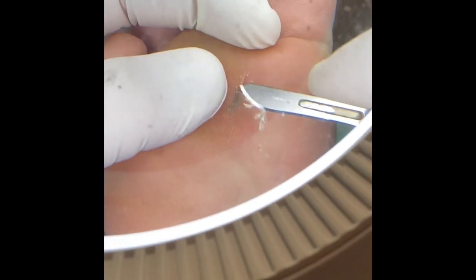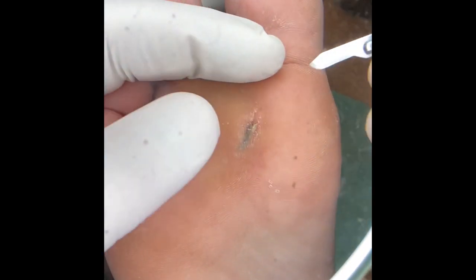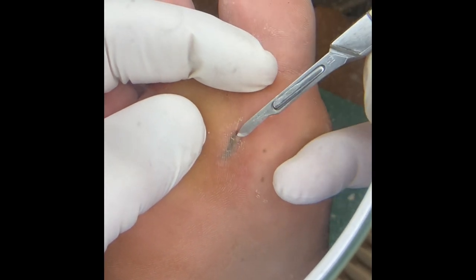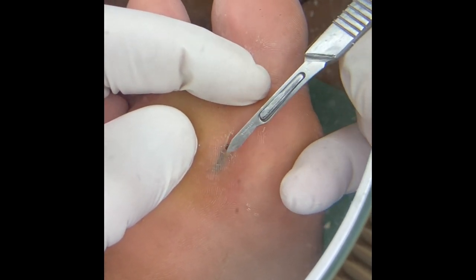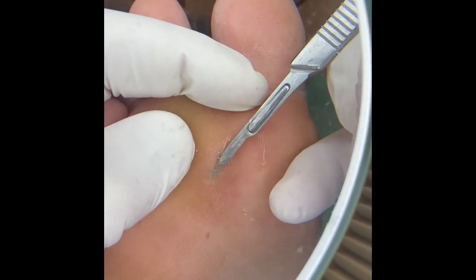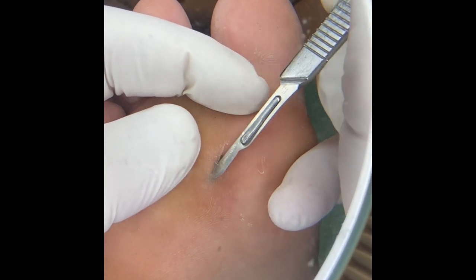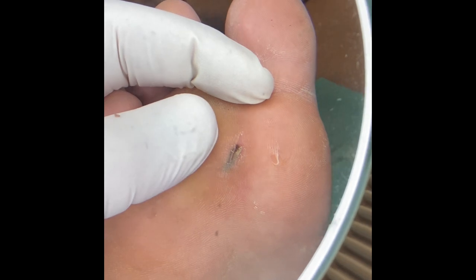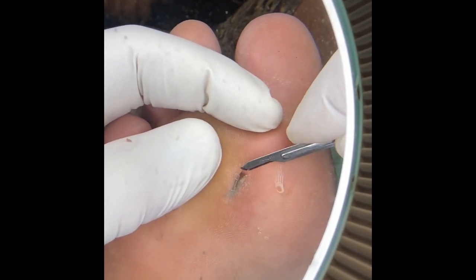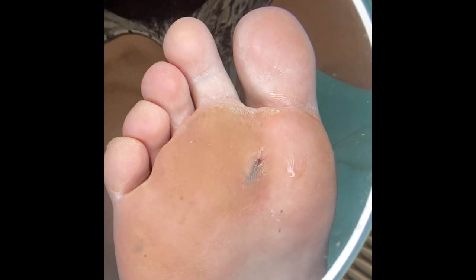I get myself into this canal and I split it open — that skin is insensate. Now I've opened it up and exposed the foreign body, and I use a sterile forcep to pull that thing out.